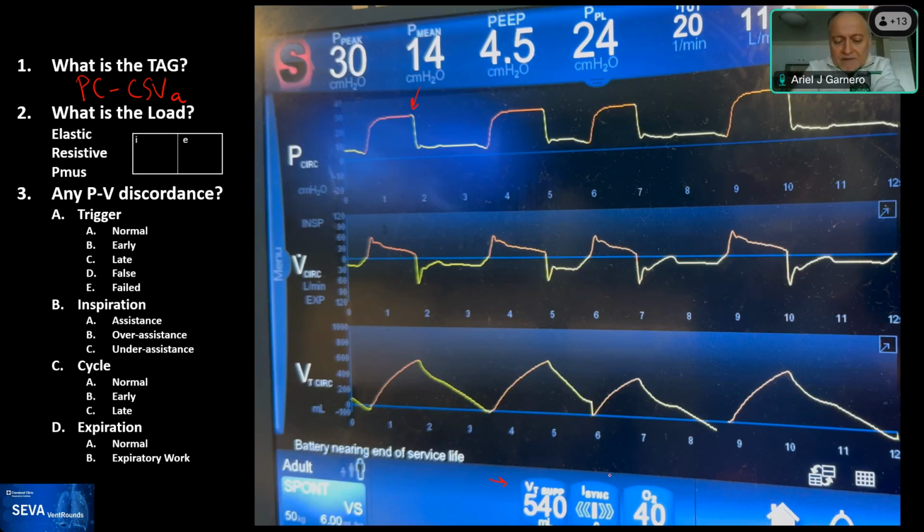So here, I think being in the patient's room was very important because the patient was struggling to even catch a breath. She was trying to pull. A week before I came on, they had tried APRV, the patient was on assist control, and I changed the patient to volume support just to gauge what's going on before we could do some interventions.